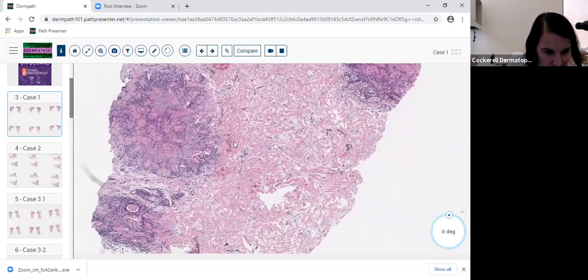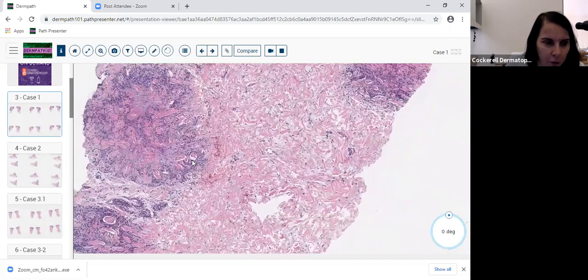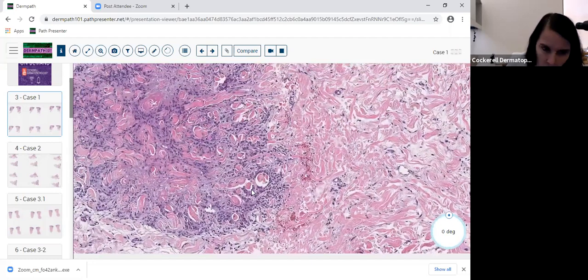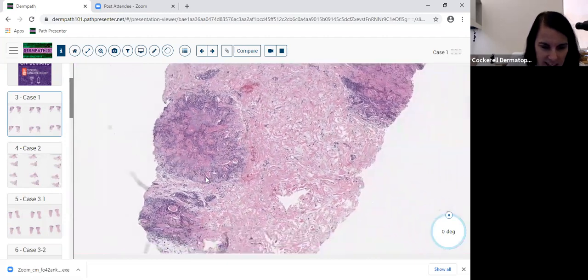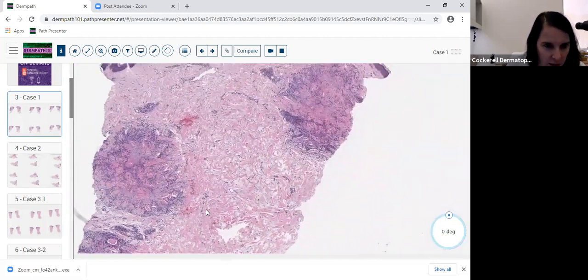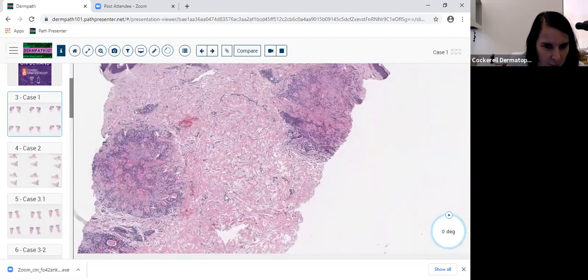And we do a lot often, but definitely look for organisms. Really quickly, just look for organisms. It doesn't hurt to look around, and I didn't see any. So we don't really need to do the stains because we had that clinical path correlation. We don't see a lot of neutrophils or tons of giant cells, and so we wouldn't do it on this case. So this is granuloma annulare.